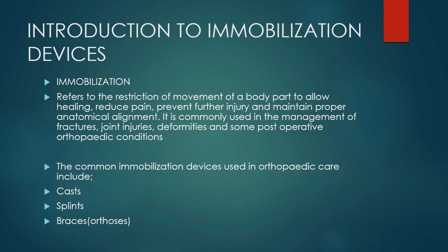So the most common immobilizing devices used in orthopedic care include casts, splints, braces, and orthoses. But in this presentation, we are going to focus our lens on casts.